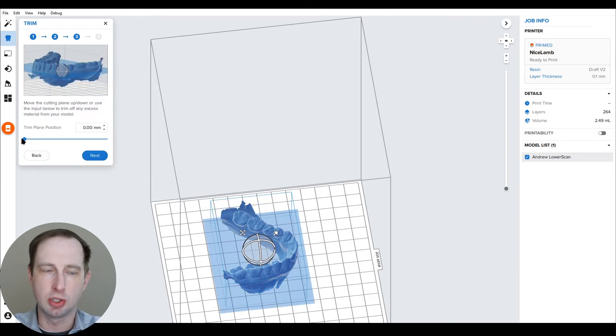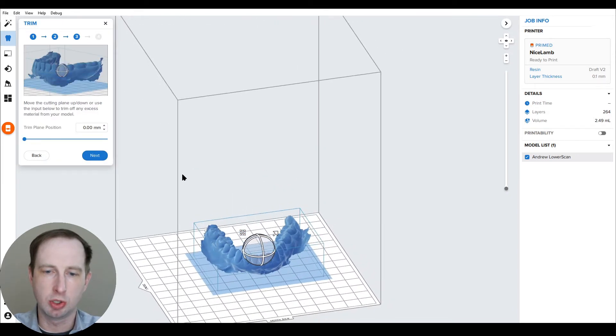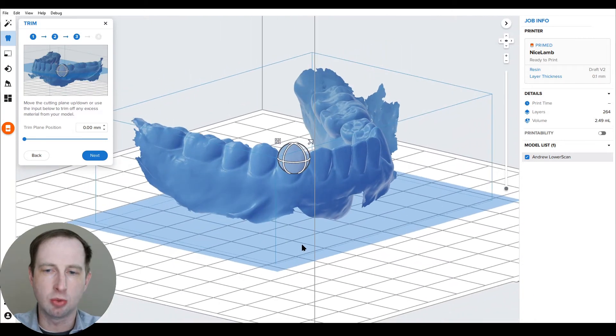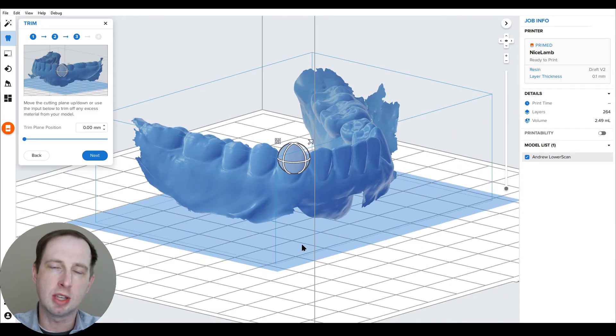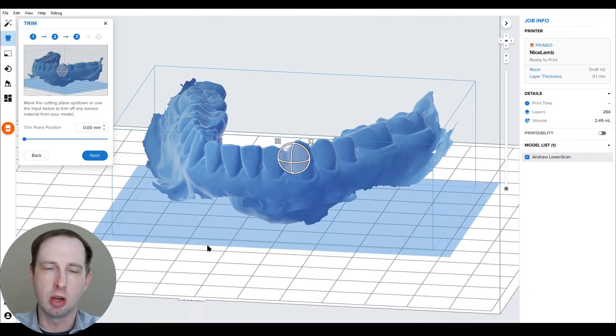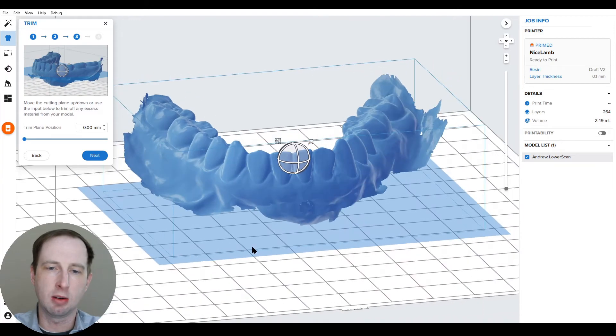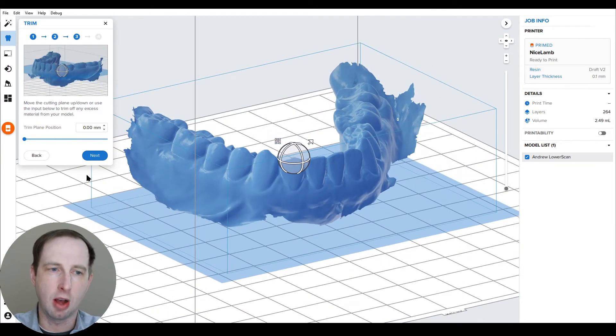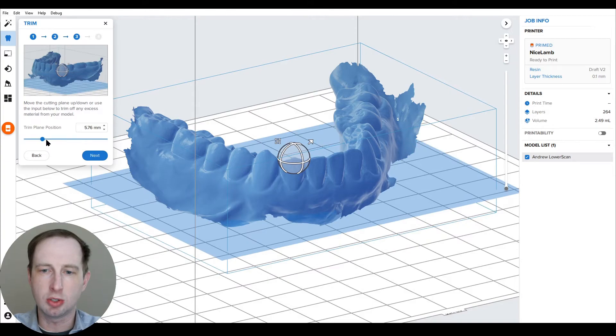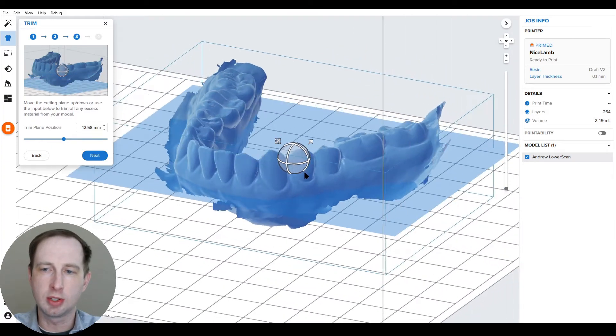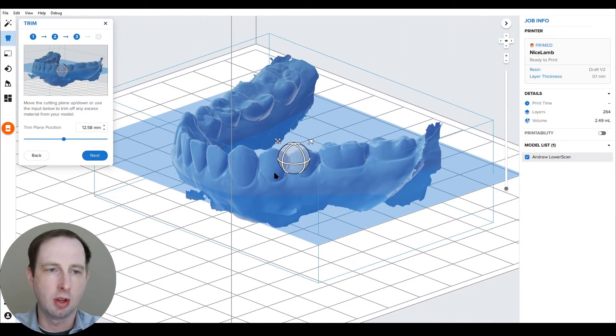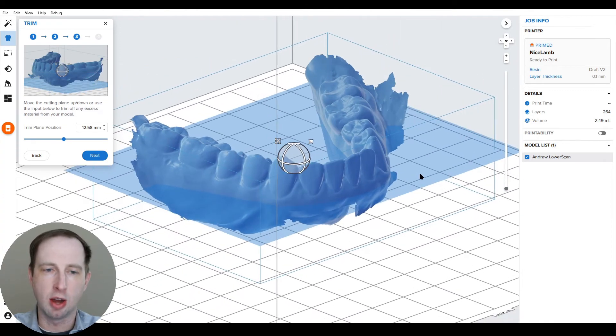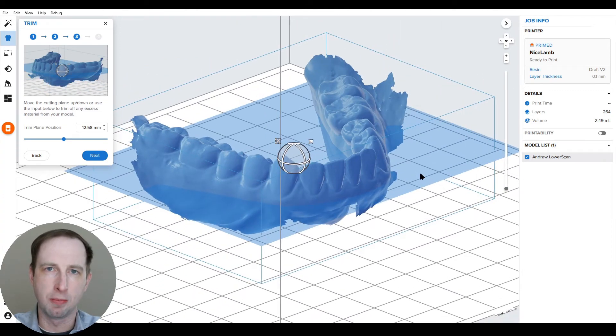The trim position, which defaults at zero, is where the scan will be trimmed. If you want to clean up extraneous data or non-critical parts of the scan, this is the way to do it. You just drag this slider and review what it's cutting. That's where it's going to cut and extrude from.